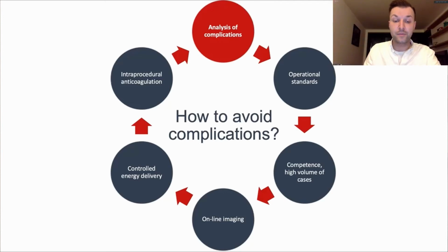Competence and high volume of cases relate to experience of the operator, and online imaging, focusing on online assessment of anatomy, prevention of thromboembolism, and early detection of complications. Then controlled energy delivery, avoiding steam pop and perforation, and intraprocedural anticoagulation to prevent thromboembolism, and so on, over and over.